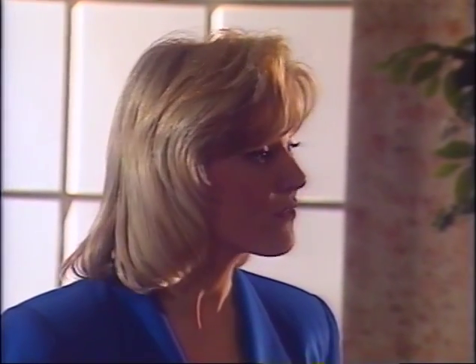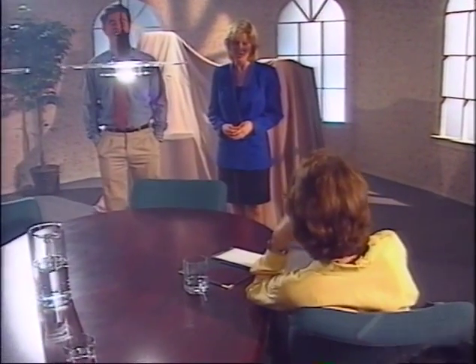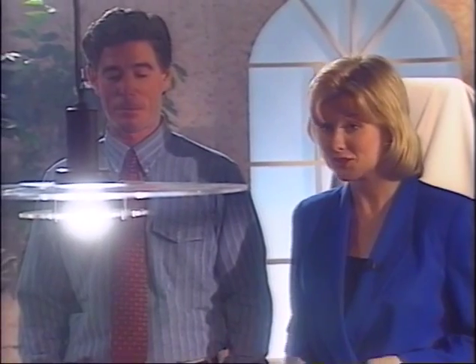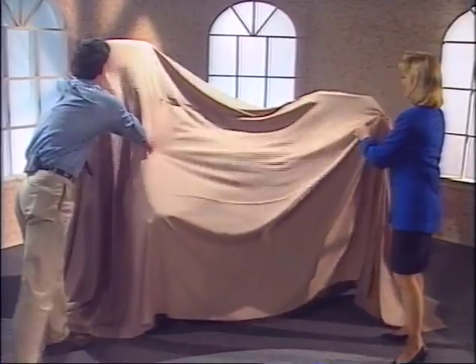CYBEX first contacted existing domestic and international customers and asked them what features they wanted most in a testing and rehabilitation system. We then looked at the competition and evaluated the strengths and weaknesses of their systems. We interviewed hundreds of physical therapists and physicians and analyzed all the practical and clinical feedback we received. The result of all this research? That's why we're here today. Are you ready, Tom? Ready.